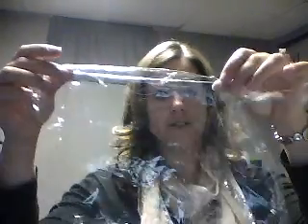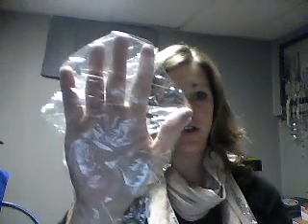So how do we get these little suckers on here? And you can see it's just a little pad. Because of barriers and we want things to stay nice and clean, a thin sheet of plastic, which is just a piece of saran wrap, is going to cover the affected area. And you want it to be something clear, so the light can penetrate to the tissue. So you can see I have my hand covered in the plastic.